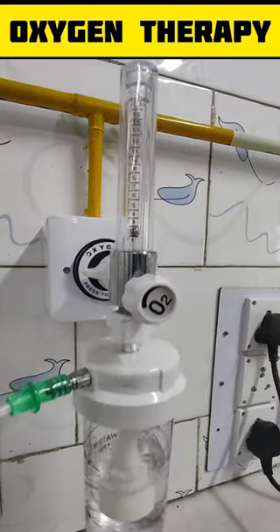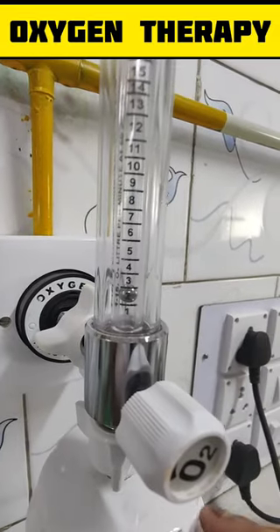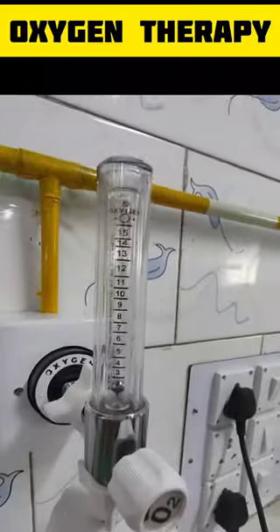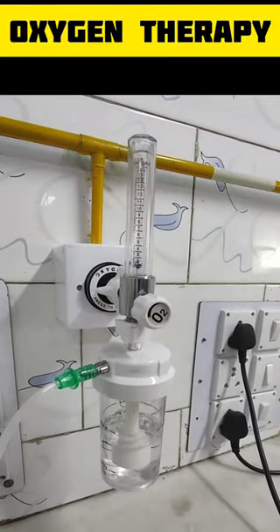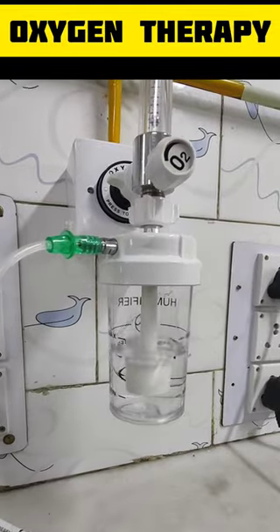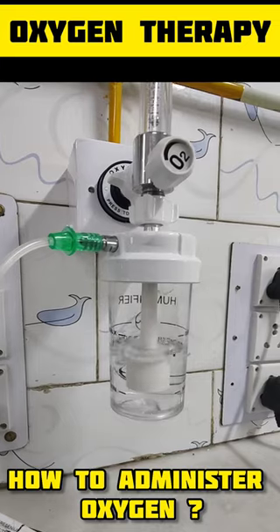Hello everybody, today we will discuss how to administer oxygen to a neonate. Oxygen is a drug and should only be used if the baby has hypoxia. Excessive oxygen is harmful to the eyes, brain, and lungs of the baby.